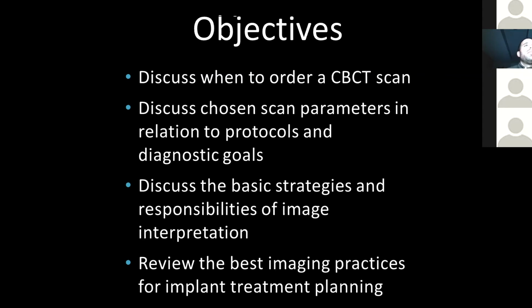From the technical perspective, if you need to see hard tissue things, go with cone beam CT. It's just as good as medical CT. If you need to see soft tissue and specifically the disc, you have to be looking at MRI. So Dr. Schiffman, you and I can discuss that more at length at another time if you'd like.